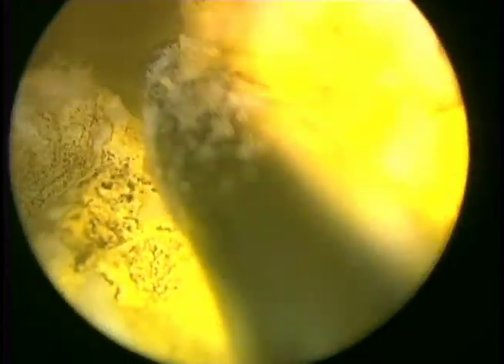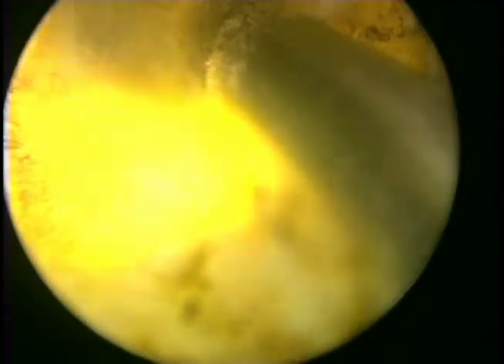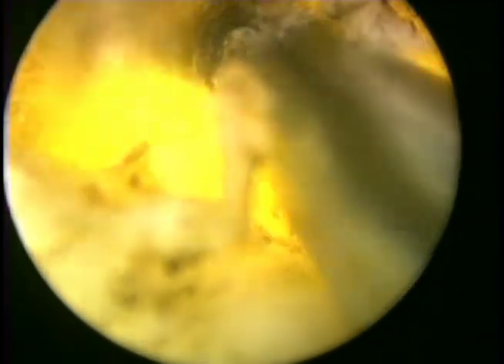After taking a look back from the verumontanum, we see that our 7 o'clock groove is quite well defined, but our right-sided, or the 5 o'clock, groove has not. So as such, we're going to take a little bit more time and create a symmetric groove down to the capsule. We are a bit thrown off, as mentioned, because of the asymmetry, and we are simply taking the time to adapt and create the working space and the grooves that we intend to have on every case, no matter what.